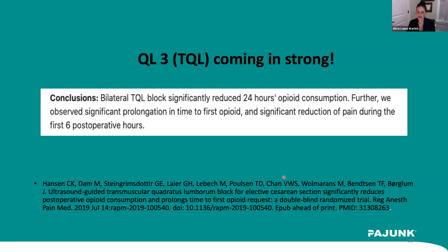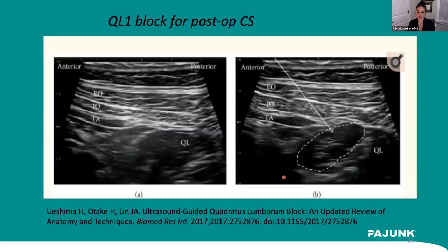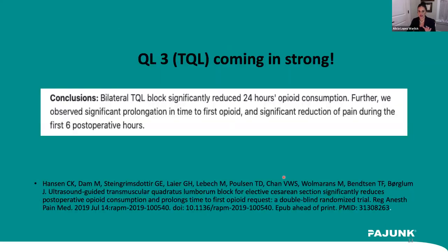The reason that I choose to do the QL1, and I think that's next, I'll tell you that I use the QL1 for postoperative C-section purely because of logistics, okay? In the busy private practice that I'm in, oftentimes you're not only dealing with OB, but you have other operating rooms to deal with, and sometimes those OB wards are remote, right? They're sometimes far away from your operating room.